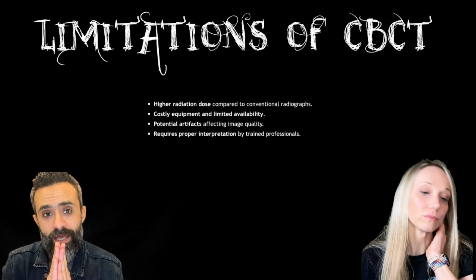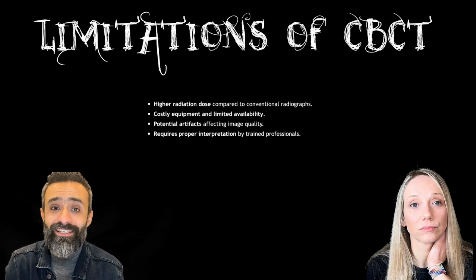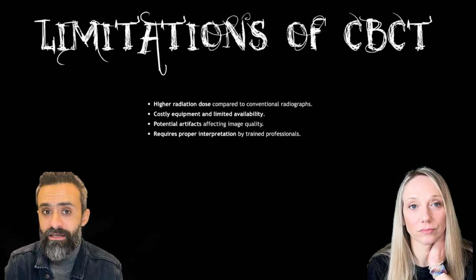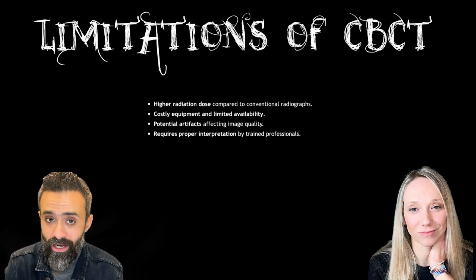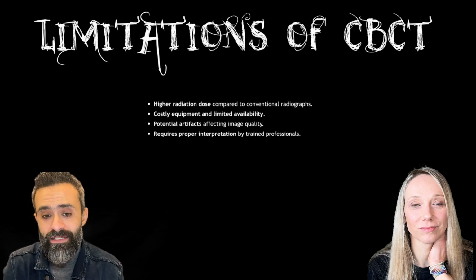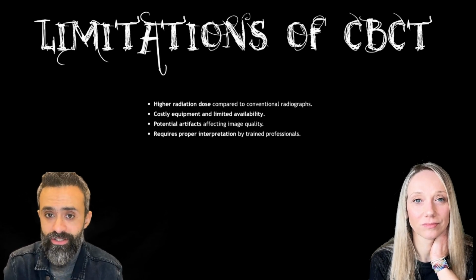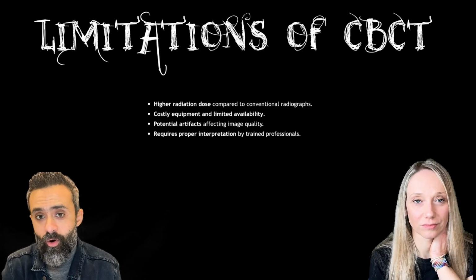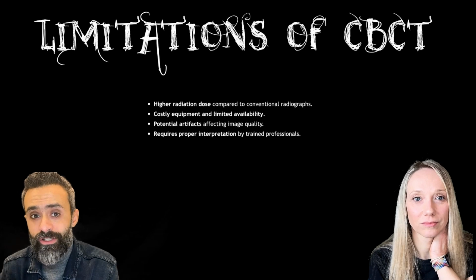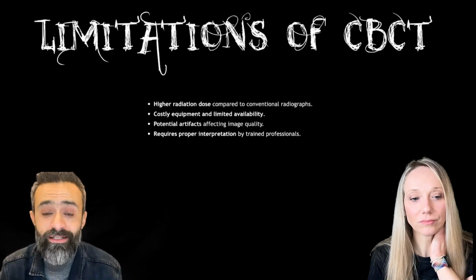Also, we have to send a message to our colleagues that every scan has to be justified. We cannot just do a CBCT scan on a regular basis in easy cases that can be visualized using conventional two-dimensional radiographs. If the CBCT scan has no impact on the diagnosis, decision making, the treatment plan or the prognosis of the case, I think this is considered overtreatment, something that's not needed.